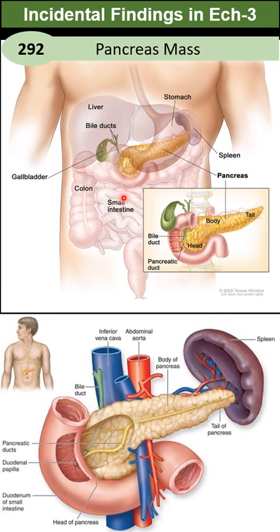Here is the location of the pancreas and relationship with other organs. As you can see, we have skin, muscle, liver. Below the liver, we have stomach. Then we have pancreas, and posterior to the pancreas, at two levels, at the midline right, IVC, midline left, aorta, and between them, portal vein.